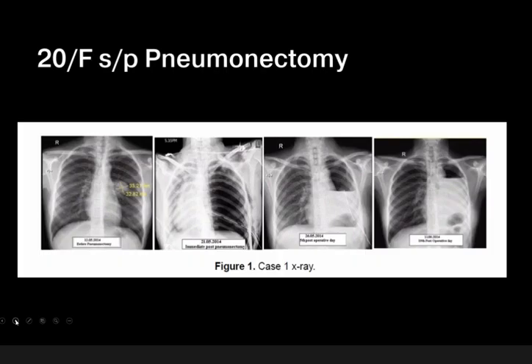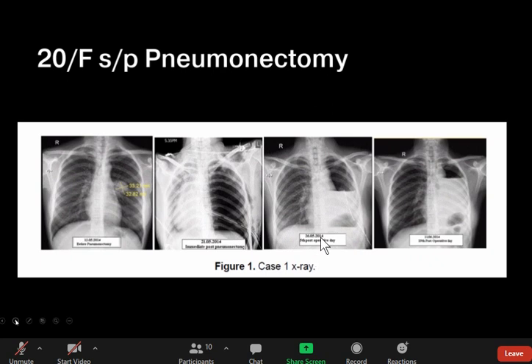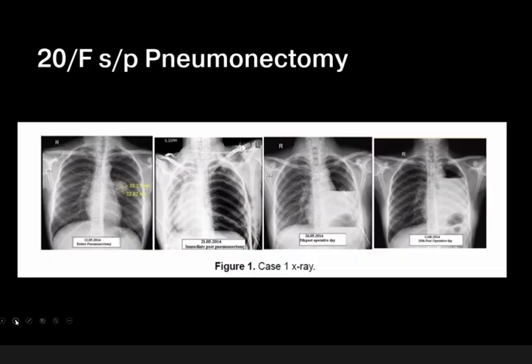Next, this is another case wherein we would see the trachea shifted towards the opacified side: patients that are status post pneumonectomy. I'd just like to discuss some of the changes that we'd expect after pneumonectomy. Here in the first image, we would see the mass, and this second image is immediately post pneumonectomy, and you'll notice that the side that was pneumonectomized is completely filled with air. Within the first 24 hours, usually we just see that this side is filled with air, but after this period, we would see that it is becoming filled with serosanguinous fluid. Usually, it increases by around two rib spaces per day. And by the end of months, there is complete obliteration of that side, opacification with the fluid.